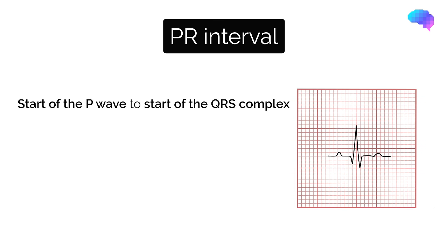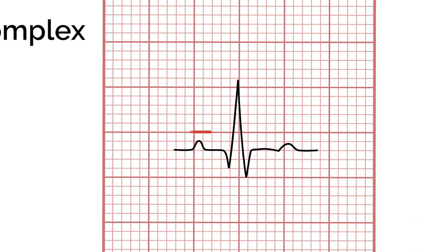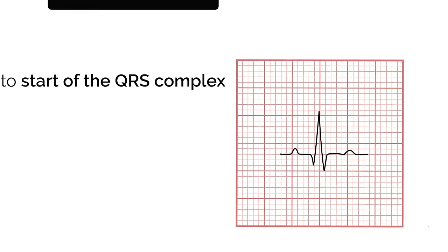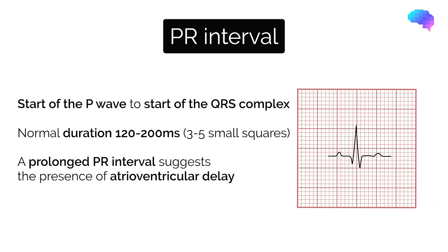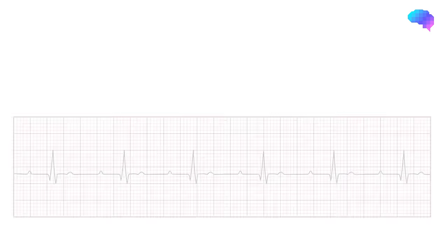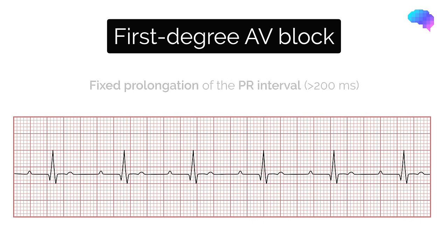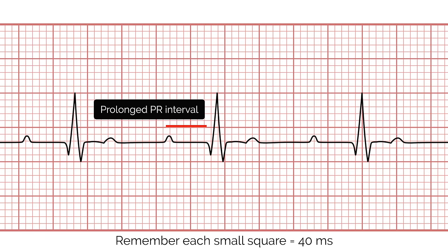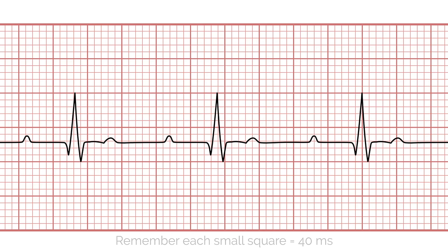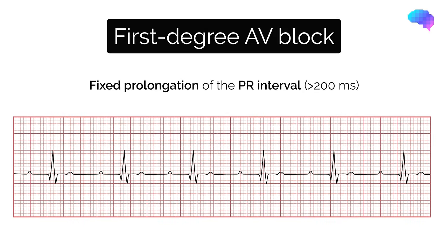The PR interval should be between 120 and 200 milliseconds, that is 3 to 5 small squares. A prolonged PR interval suggests the presence of atrioventricular delay or an AV block. First degree AV block involves the consistent prolongation of the PR interval, defined as greater than 200 milliseconds, due to delayed conduction via the atrioventricular node. Every P wave is followed by a QRS complex and there are no dropped complexes. First degree AV block is common and can often be an incidental finding, with patients usually being asymptomatic.